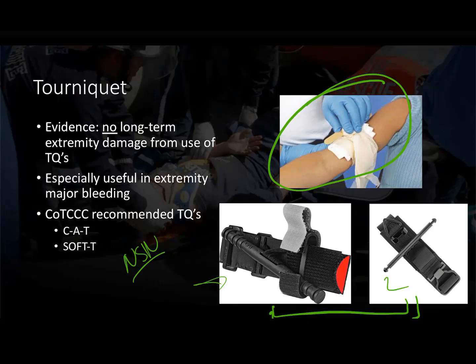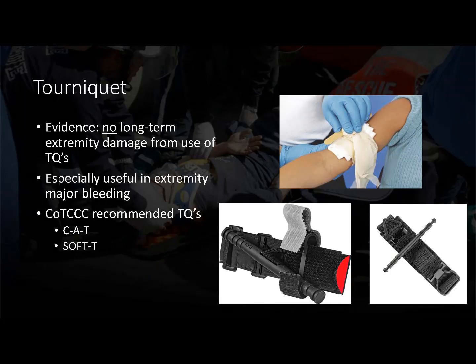Keep in mind when you're purchasing tourniquets for yourself or for your department, you want to make sure that it's the actual tourniquet and it comes from a reputable source, and generally you can tell it's the right tourniquet because it has an NSN number on it. There are copycat tourniquets that are being created. Unfortunately, they're created to look exactly like the actual tourniquets. They're not made with the same equipment or materials, nor are they made with the same quality standard as the reputable original sources.